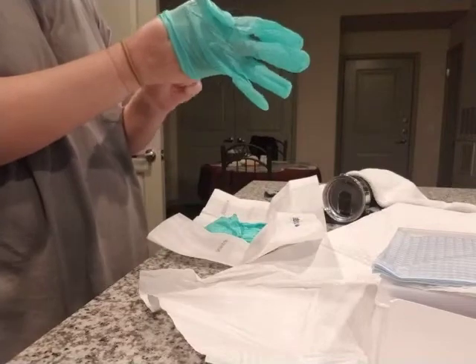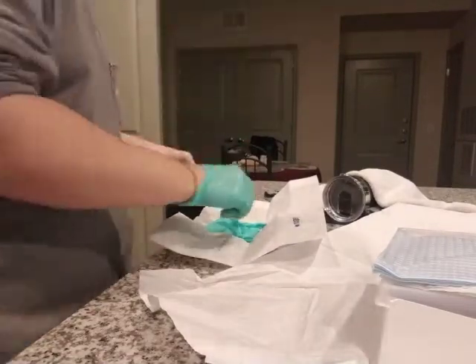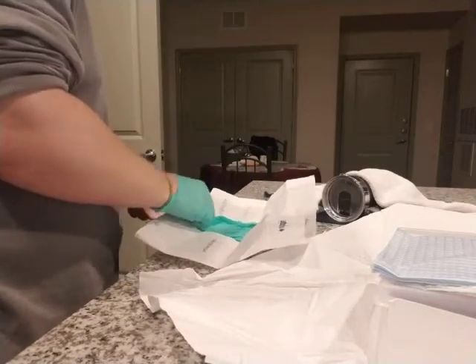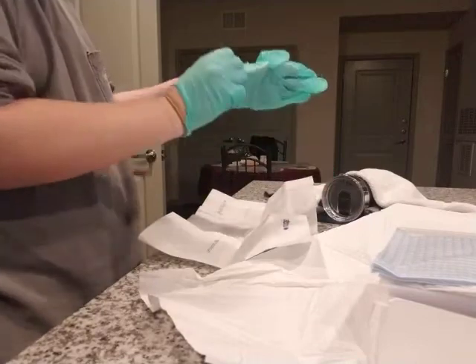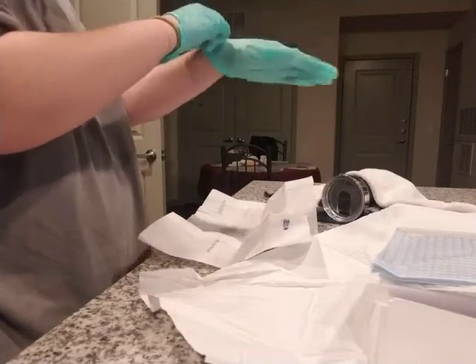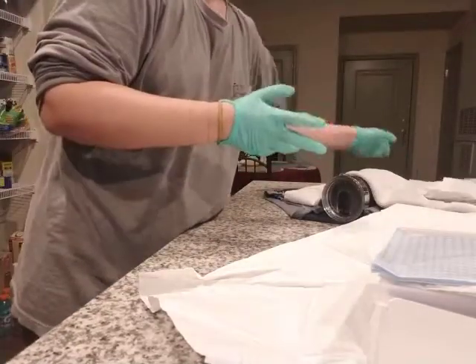I'm going to put on these sterile gloves eventually, because it is very important to maintain sterility throughout this entire procedure. I'm going to put that off to the side.